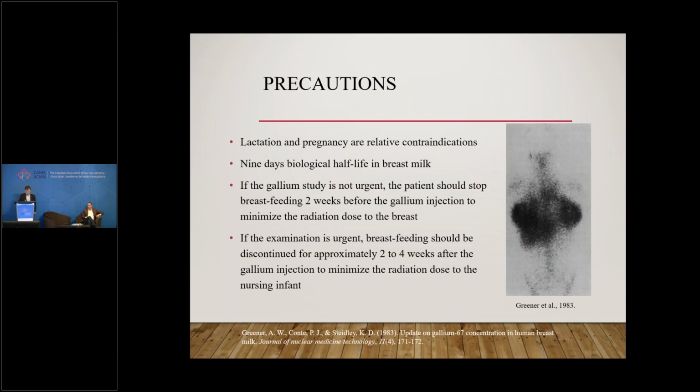Okay, so precaution. This picture on the right is a breastfeeding patient, and lactation and pregnancy are considered to be relative contraindications. As we can see, gallium avidly accumulates in the breast, with a biological half-life of 9 days in the breast milk.